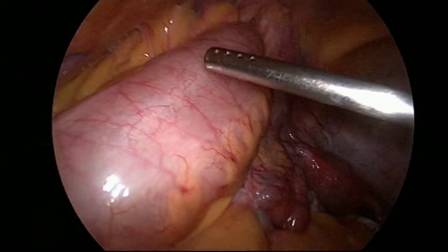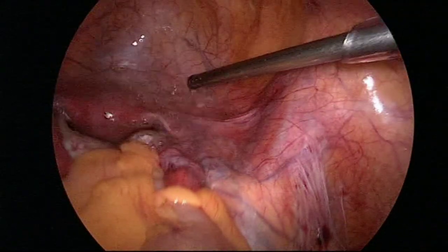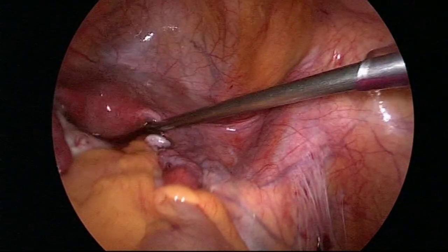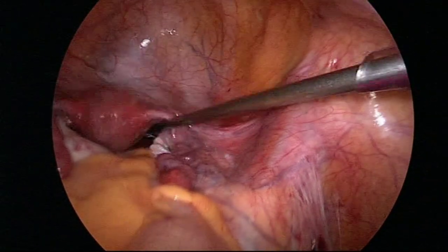Now we can see there is no bleeding at all. You can see the color of the water, it's clear. Minimal oozing, 1-2 capillaries might be there, not a problem.